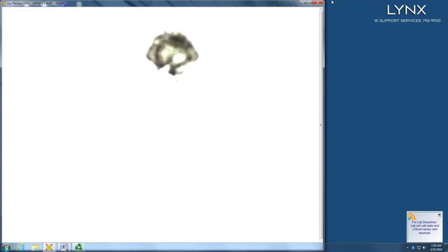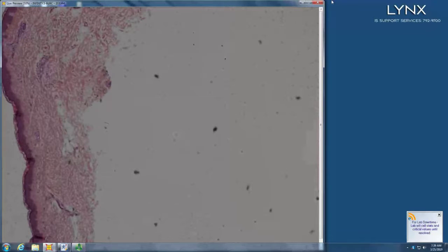I think we need to fish that other block. I think we are cutting into something, it's clearly pilosebaceous. So is it all pilomatricoma with no matrical differentiation yet, or is it a sebaceous adenoma with very little sebaceous differentiation? I'd get an EMA on it if I were dealing with it today. A broad shave or something.